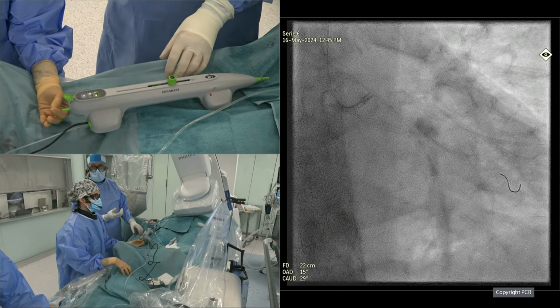Emanuele, I'm going to show you now how we do the ablation. So the first thing is that Nieves is, as you say, pressing the brake. We are safe now. We are not in glide assist mode. And I now open the knob so I can make my backward sanding. Okay? I start... we are a little bit distal, probably. What I do is I am a bit distal, Nieves. Yes, so I'm going to bring it back more proximal, I put it in glide assist. Maybe a bit more proximal, I think I'm happy with that. There, what do you think?